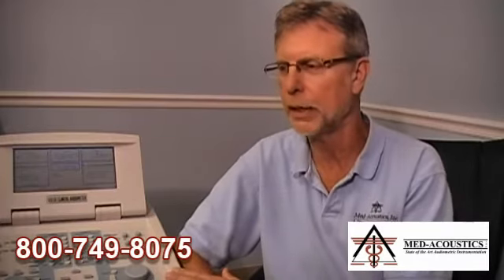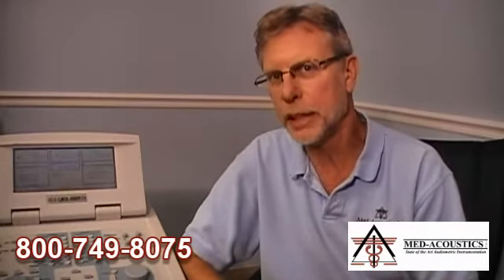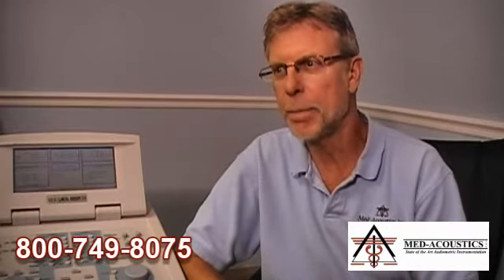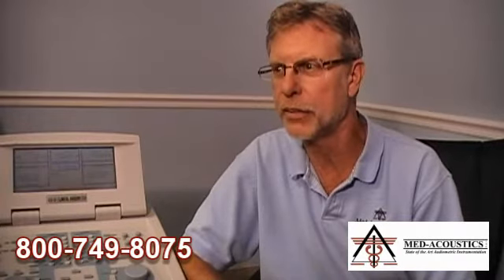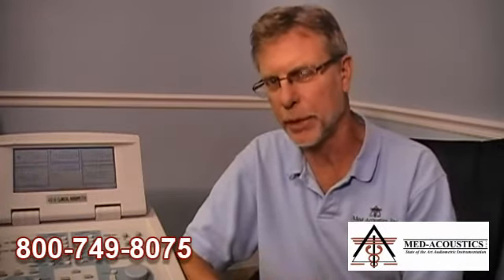We're talking about the listening check of an audiometer. I have a GSI 61 here because it is the most popular clinical two-channel audiometer in the United States, but this would apply to any audiometer, not just the GSI 61. The listening check involves listening to each transducer and determining that there is a signal present, that the signal is constant, consistent, clean, and of the proper level.